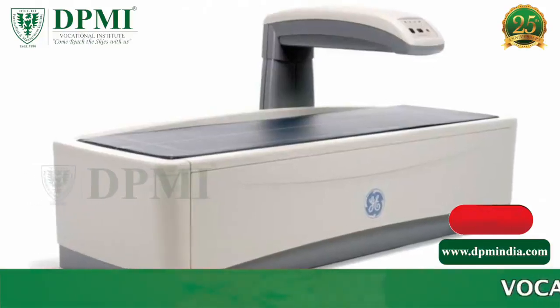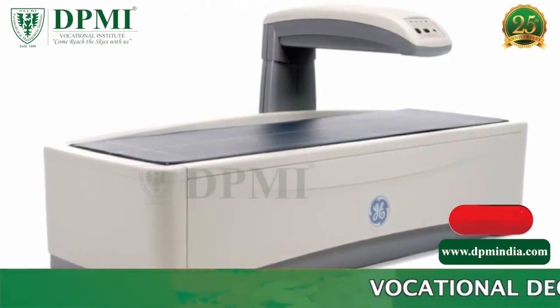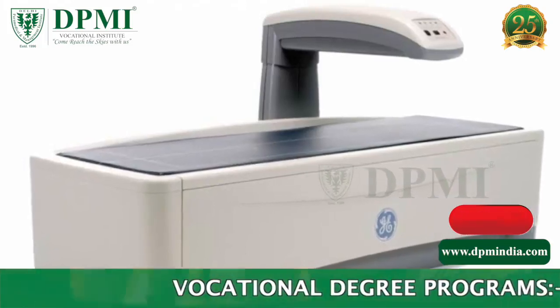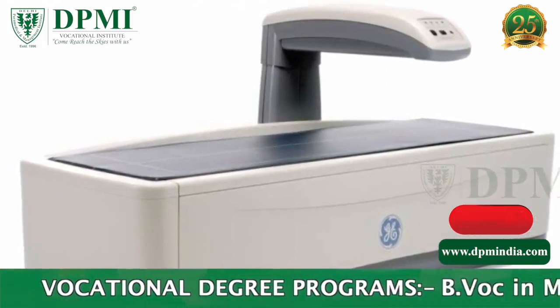DEXA stands for Dual Energy X-ray Absorptiometry. DEXA uses a very small dose of ionizing radiation to produce pictures of the inside of the body, usually the lumbar spine and hips, to measure bone loss.